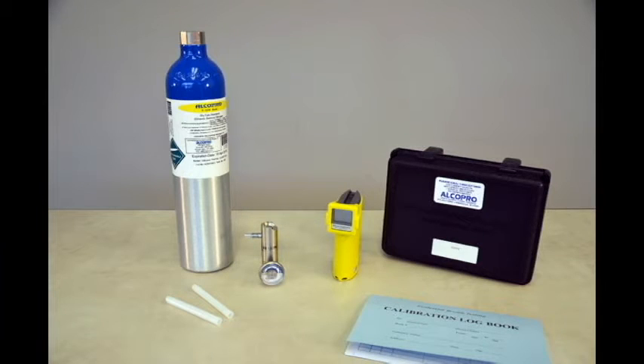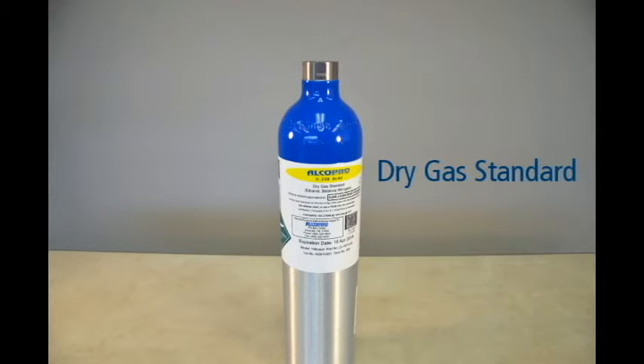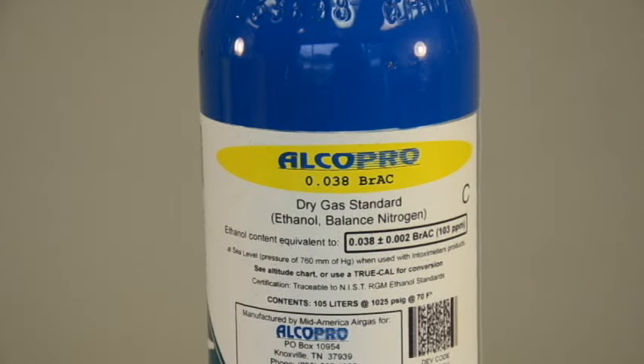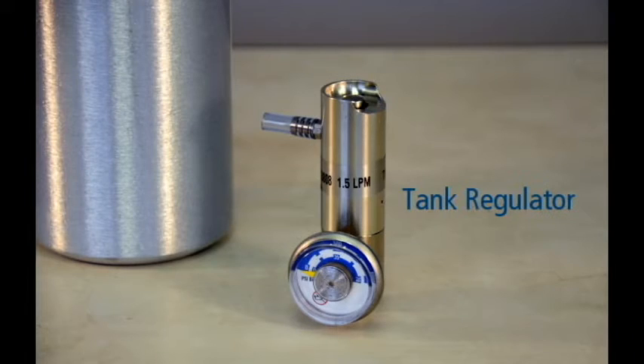To perform an accuracy check, you will need the following materials: your Alkosensor FST device and a new mouthpiece, an alcohol gas standard — we will be using a dry gas standard with an ethanol content of .038 BrAC at sea level, which can be located on the gas tank label — and a 1.5 liter per minute regulator to attach to your dry gas tank.